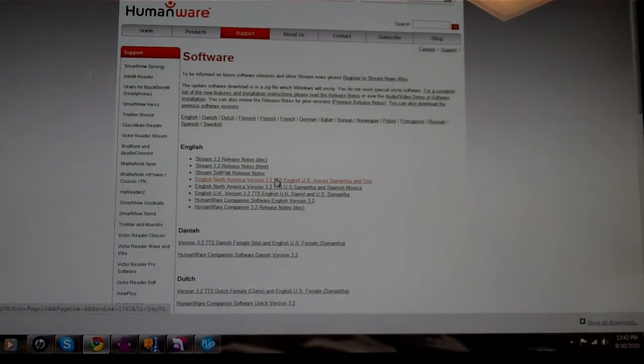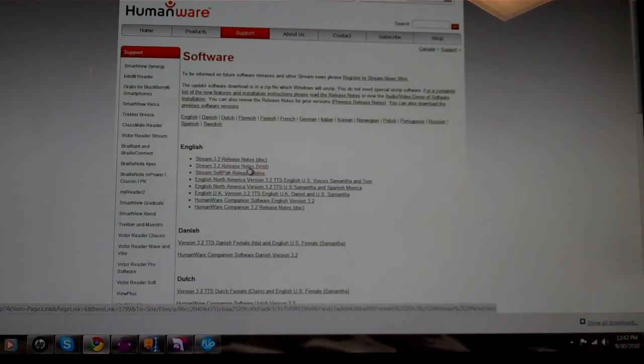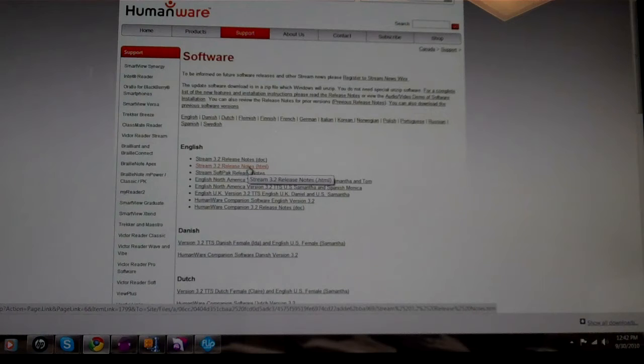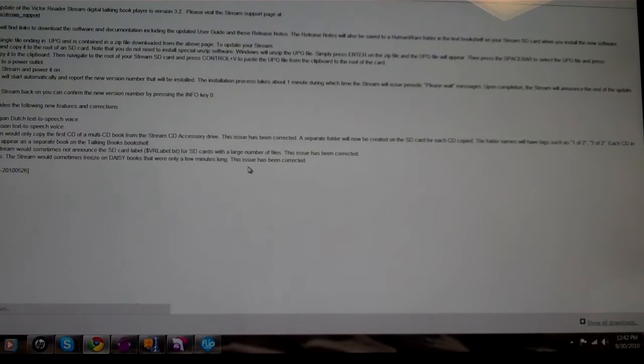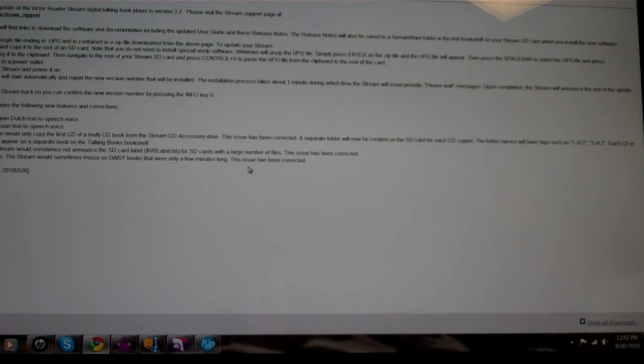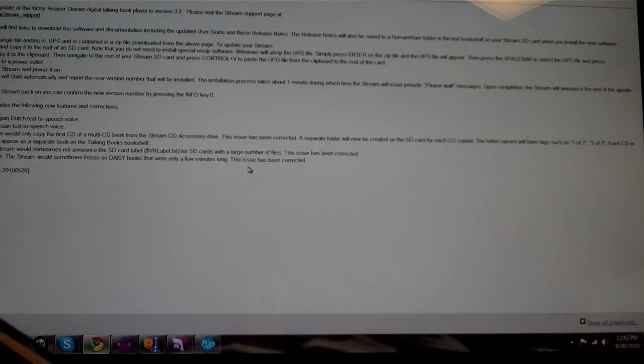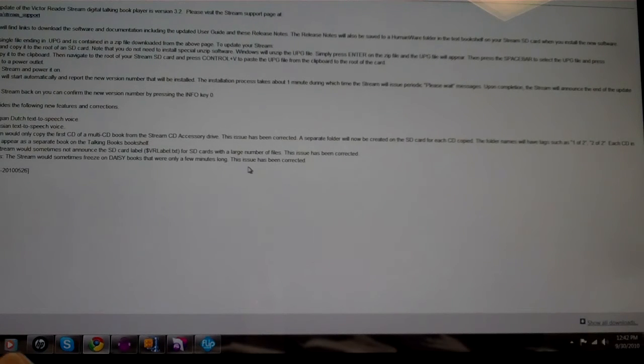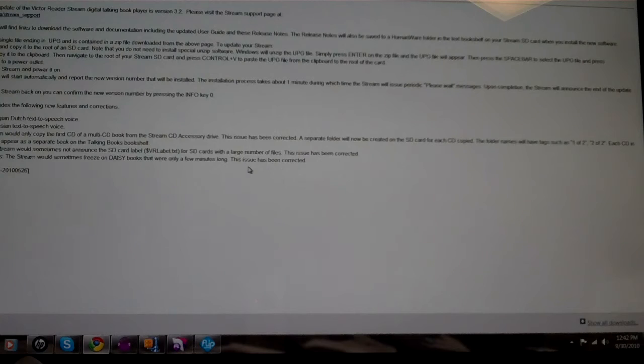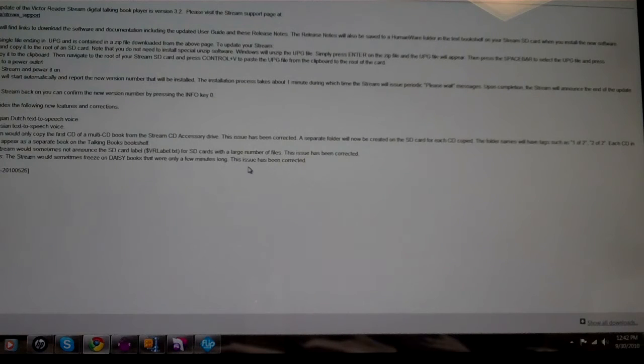it gives you step-by-step directions in the release notes but it tells you that you need to connect your stream to a power outlet. Then you insert the card and power it on and then it talks you through that it's updating your Victor Reader stream and it will tell you when it's finished.